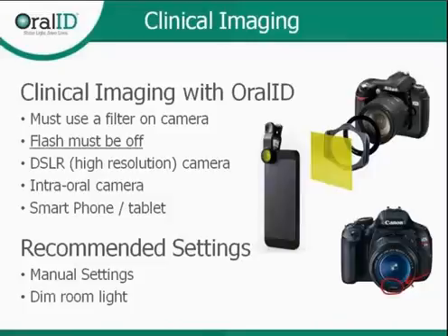You need to grab somebody to help you take a picture because you're likely holding the device with one hand and retracting with the other, so you don't have a means to pick up a phone and take a picture. So grab somebody to help you take the picture.